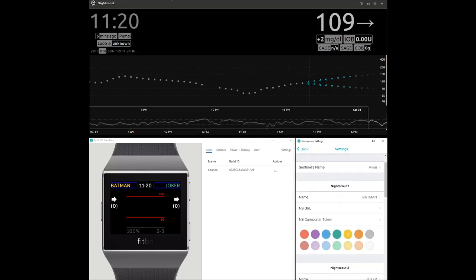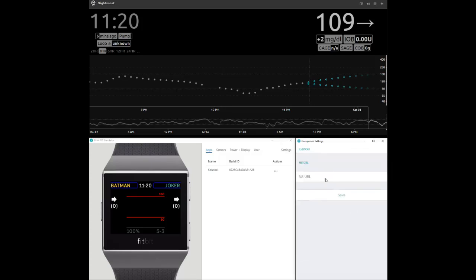To begin monitoring, add a NightScout URL to the fields labeled NS URL.